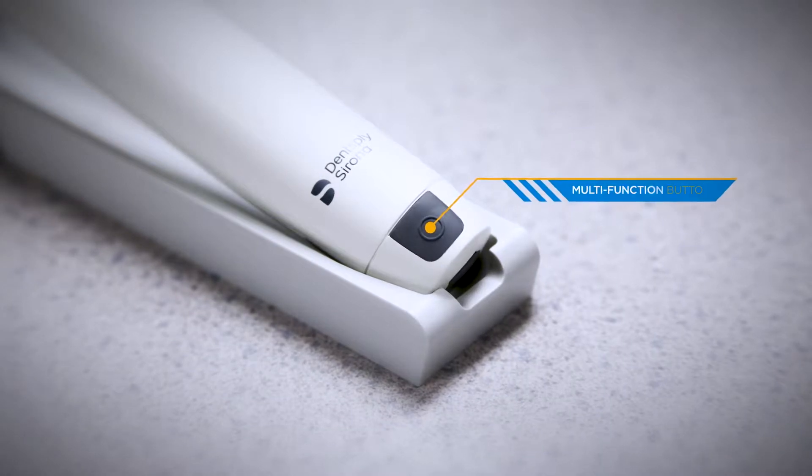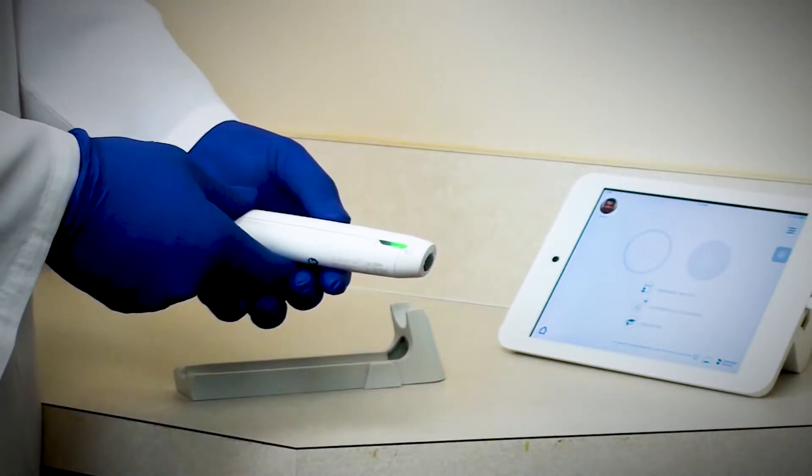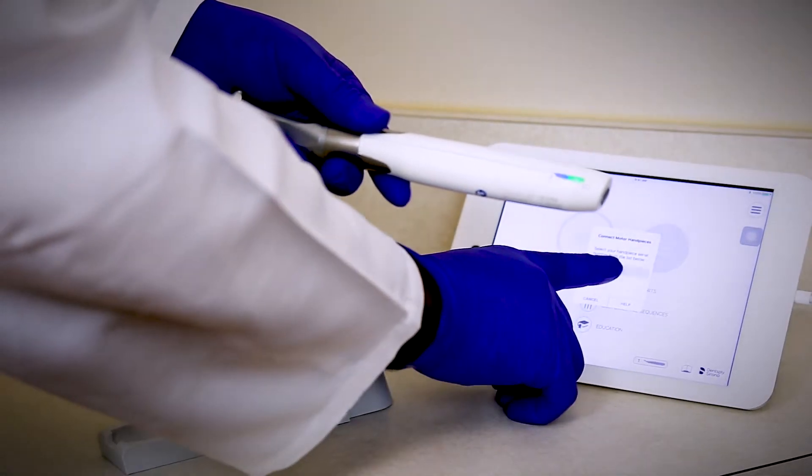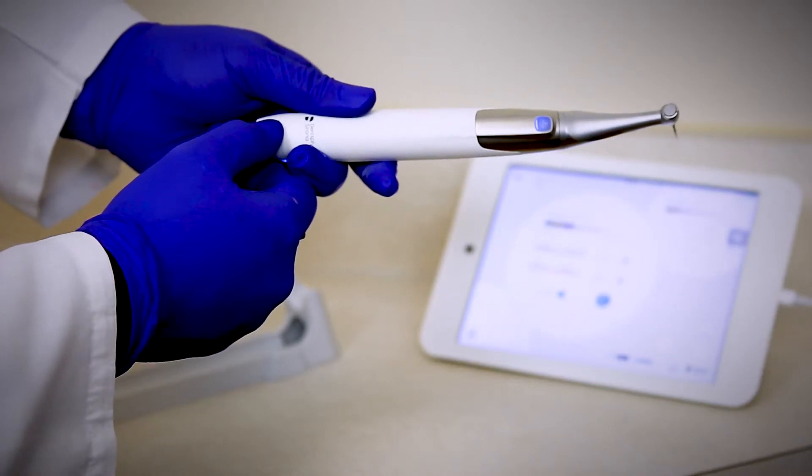At the bottom in the center is your multi-function button. This button is used to pair the motor handpiece to the application via Bluetooth, wake up the motor handpiece, and to select the next file during a treatment.